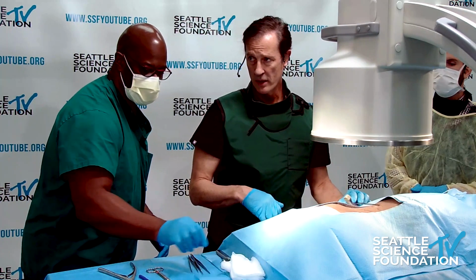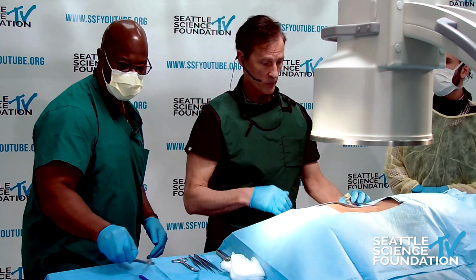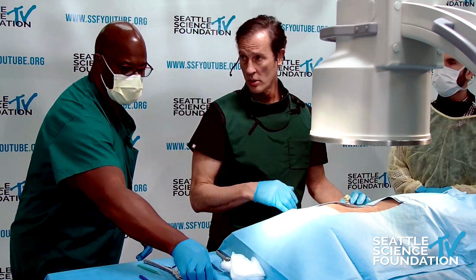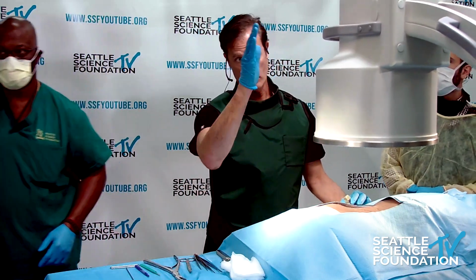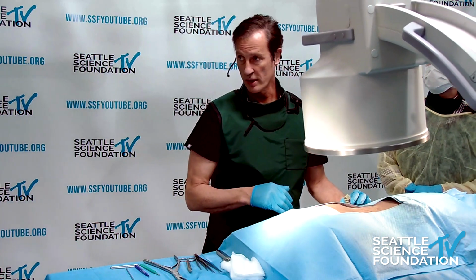All right. So let's come back. It's fine. So call it tilt. Great.